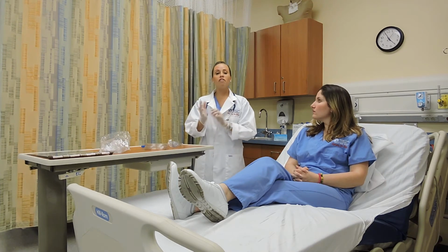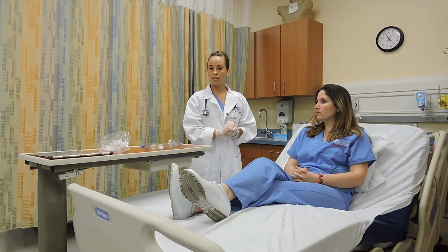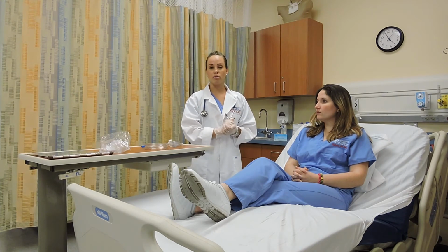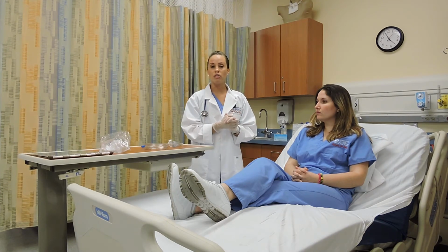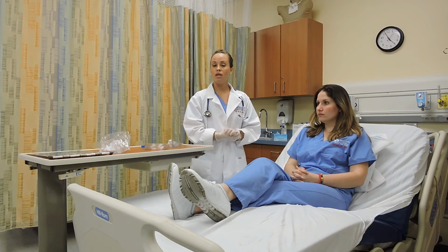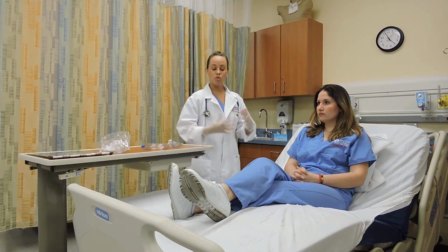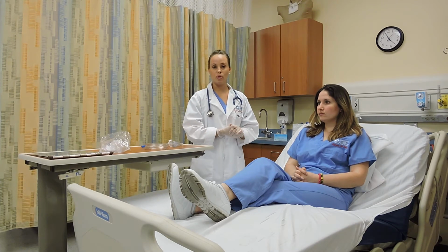Make sure to verify your patient's identity using two identifiers. This can be name and medical record number. Then you can go ahead and take your patient's vital signs. These are respiratory rate, heart rate, blood pressure, temperature, SpO2, and breath sound, which I'm only verbalizing as well.